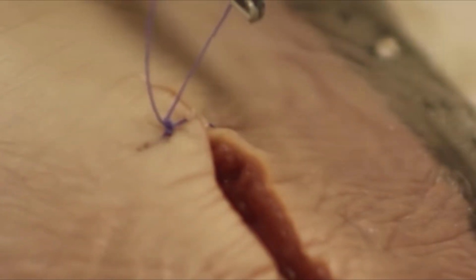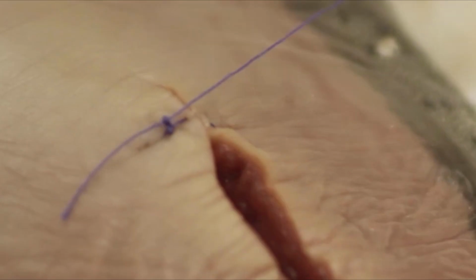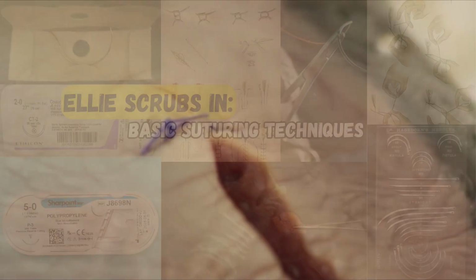A vertical mattress can avert aggressively, so stop tightening as soon as the edges are well approximated and gently everted, and avoid blanching. Trim the tails. The finished result should show good edge eversion and strong wound edge support.